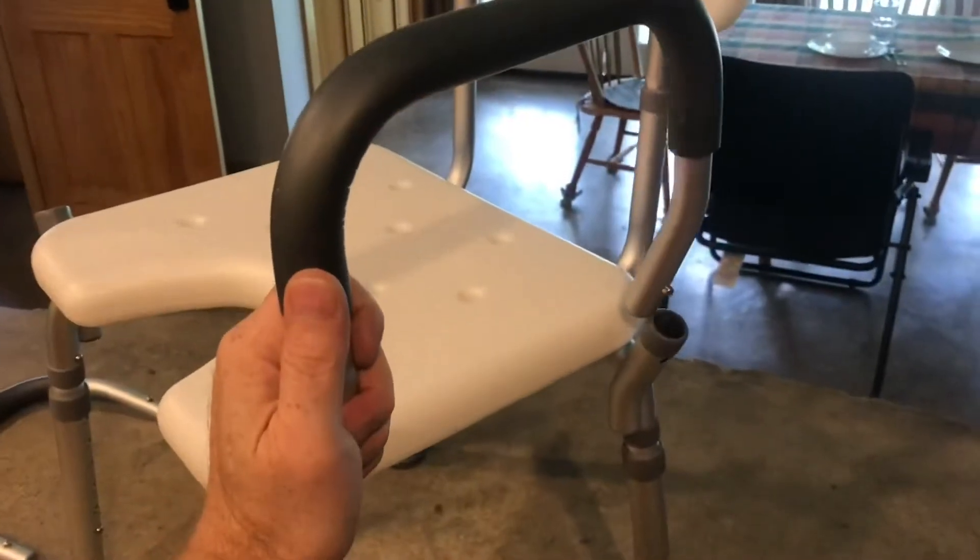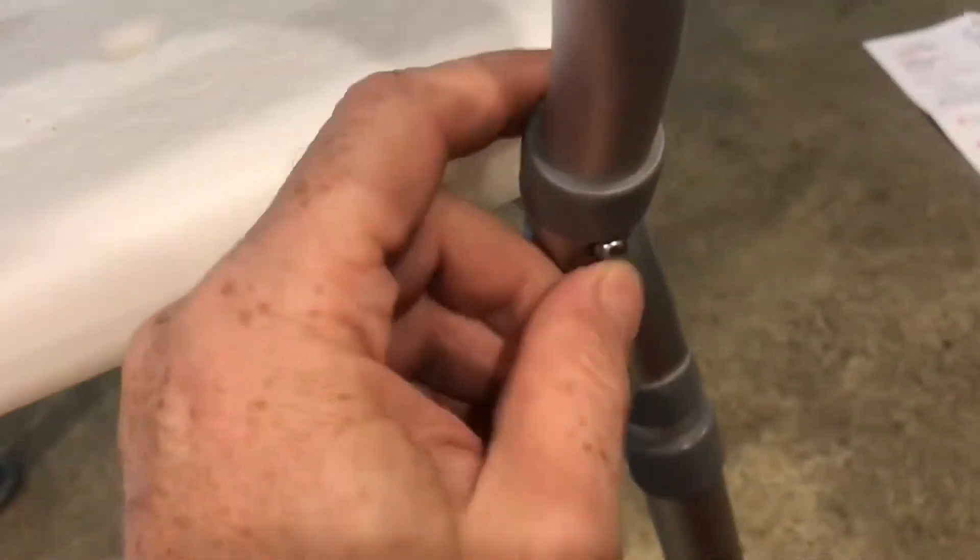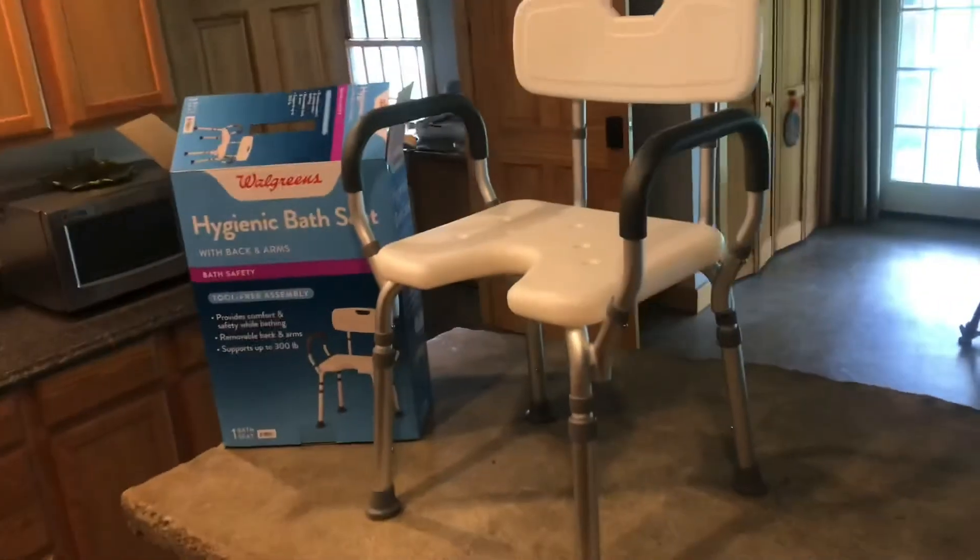Once you get used to it, you just put them in the same way. Put in the armrests the exact same way. Now it's starting to look like a chair. Not all bath chairs go together this easy, but I'm glad this one did.